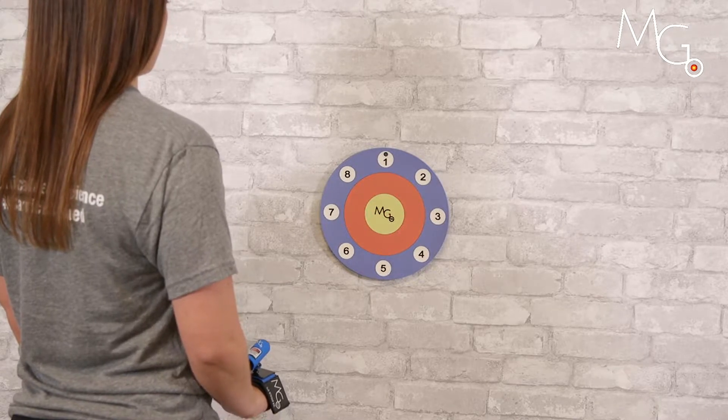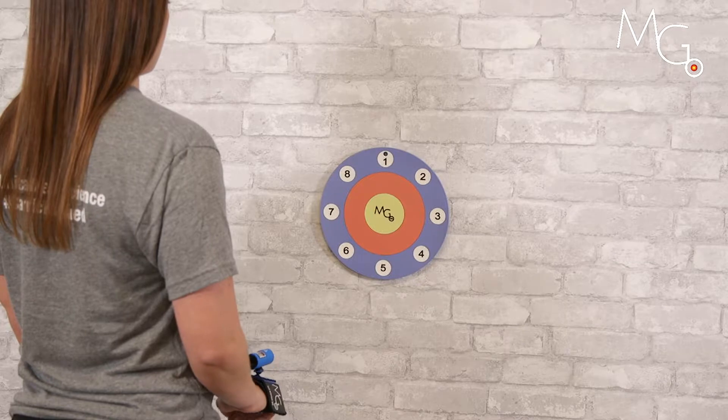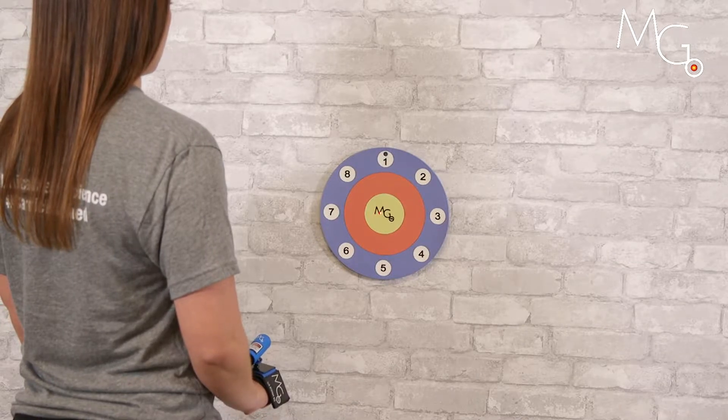I'm going to turn it back off, come back down, and then come back up. Well done.